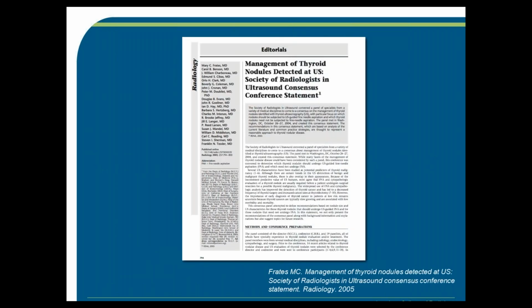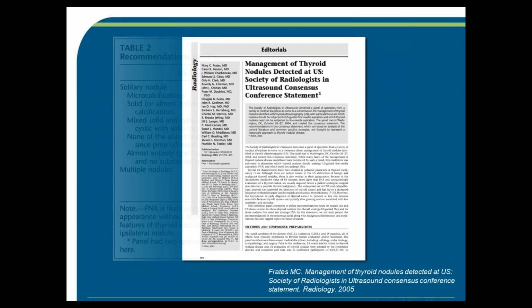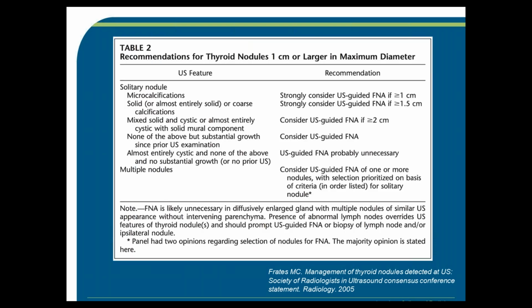Several professional groups over the years have been involved in this effort. In 2004, the Society of Radiologists in Ultrasound convened a consensus conference in Washington, D.C. And this page from the radiology article that was published the following year shows the consensus statement that was presented. Here's a table from that paper.